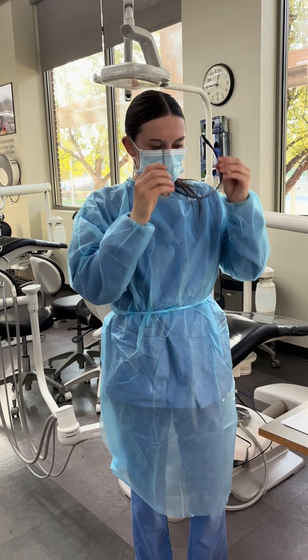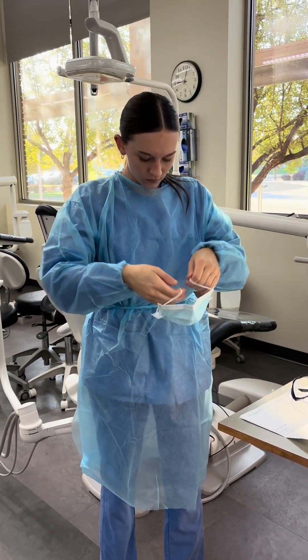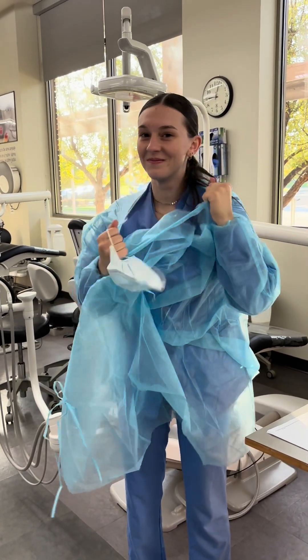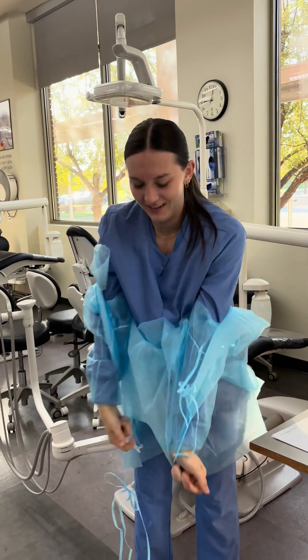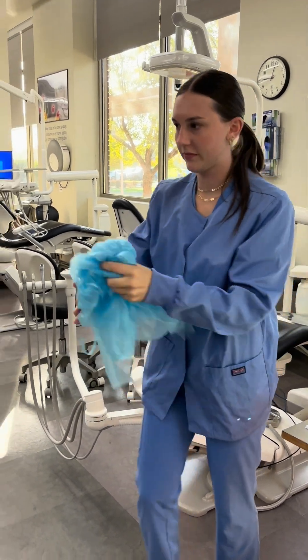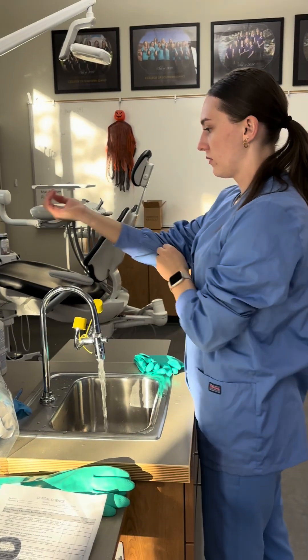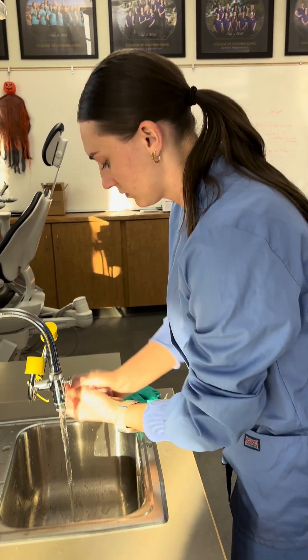And now she's going to take off all PPE, starting with the glasses, mask next, and lastly the jacket. She's going to throw it away. And to finish, she's going to wash her hands for hand hygiene.